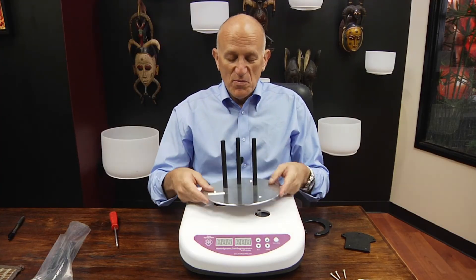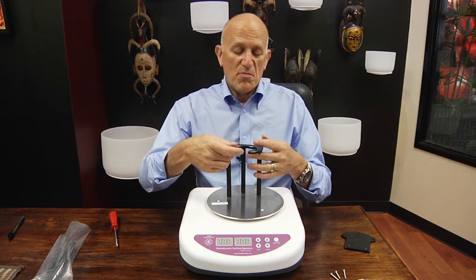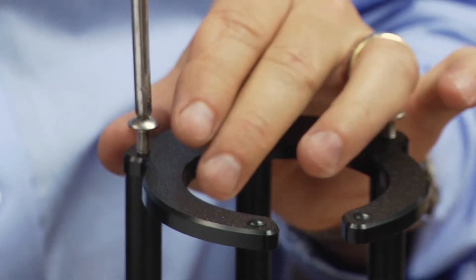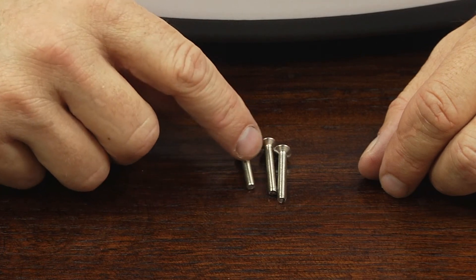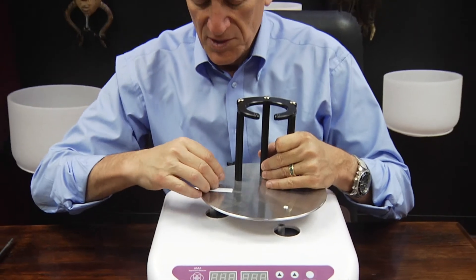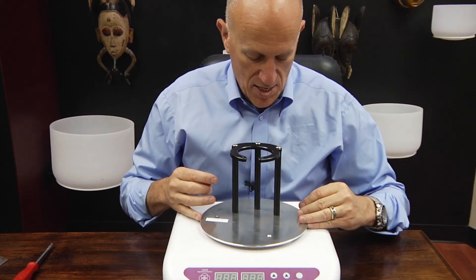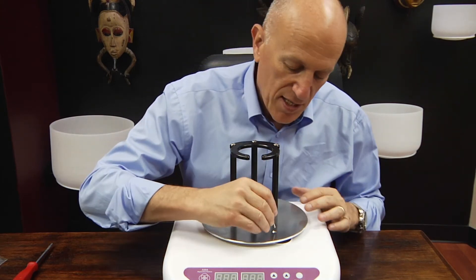Now that the columns are assembled, we simply put the cradle top on. This is where the bottle or the IV set sits. Here are the three screws — this is the shortest one, and that's the one that goes into this hole here. So you line it up: short screw, long screw, and long screw.